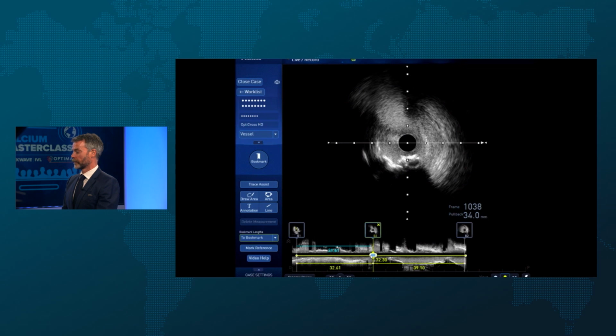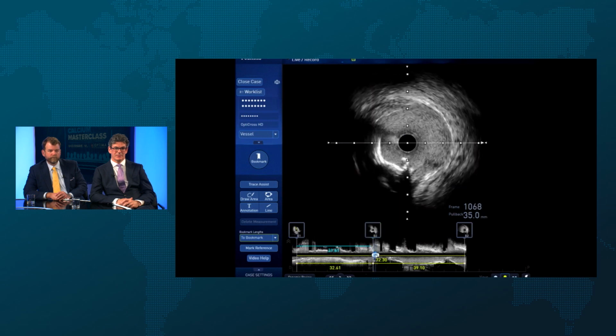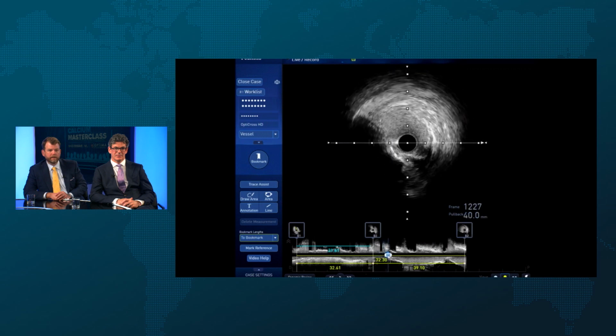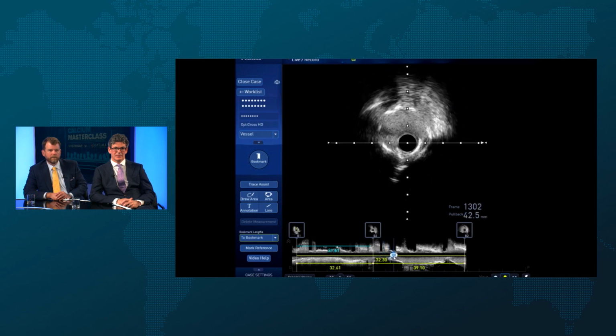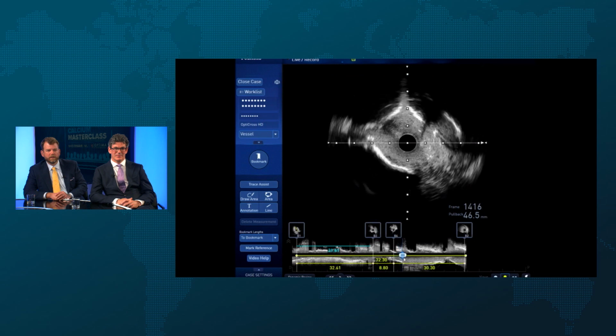Okay. So if we landed distal to the aneurysm with the first stent, we're looking at kind of a 20, 32 region. Or if we came more proximally, it's about there. Because you're going to be 1, 2, 3, 4, so that's going to be 40. So if we took a 40, it's probably going to be about here.